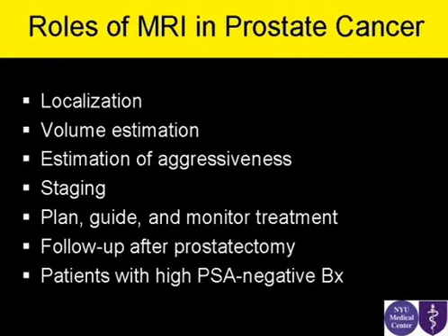So why do we need to use MRI in prostate cancer? It can be used to localize the cancer in patients with known prostate cancer. So basically, the usual clinical scenario: a patient has high PSA or abnormal rectal examination, will get PSA detection, high PSA, will get 6 biopsies done by the urologist under sonographic guidance, and then that patient can have an MRI 3 to 6 weeks after the biopsy to avoid hemorrhage, of course, and then you can try to localize the cancer. You can try to estimate the volume of the tumor also, which could be a possible prognostic indicator.